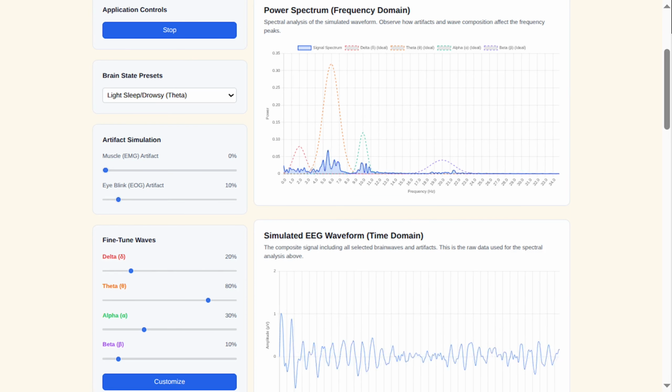So say if you're looking at the cross-section of the head, where else can EEG be recorded from? In a cross-section of the head, EEG is primarily recorded from the scalp surface. Beyond the scalp, deeper recordings would involve intracranial electrodes placed on the brain surface or within brain tissue.